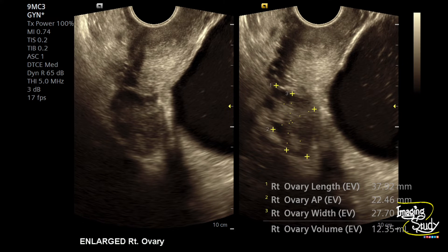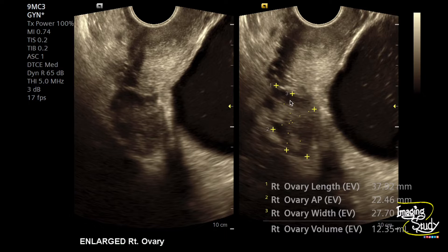Here's the right ovary — it's enlarged in size and you can see some tiny follicles. Now let's look at the left adnexa.